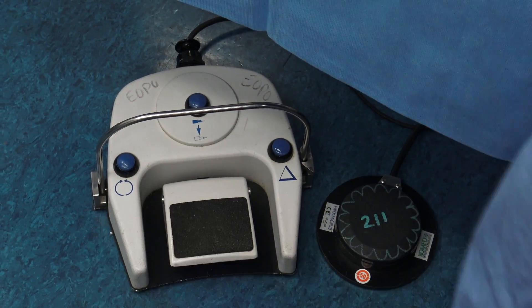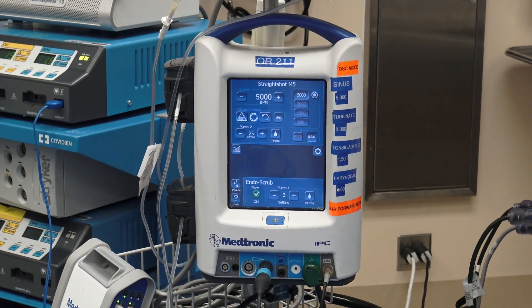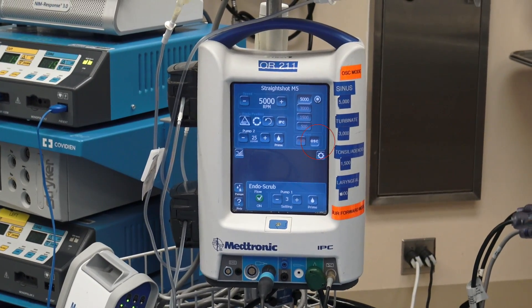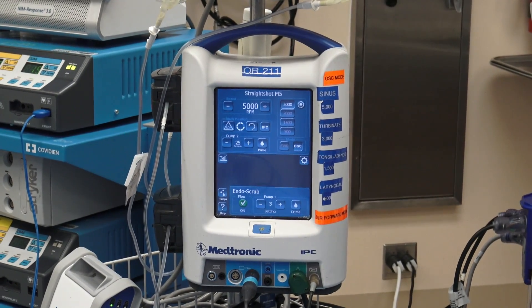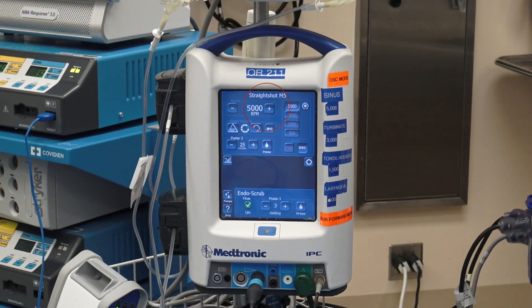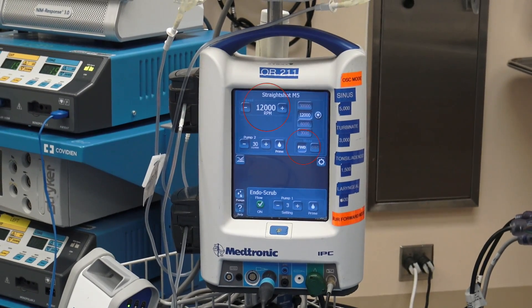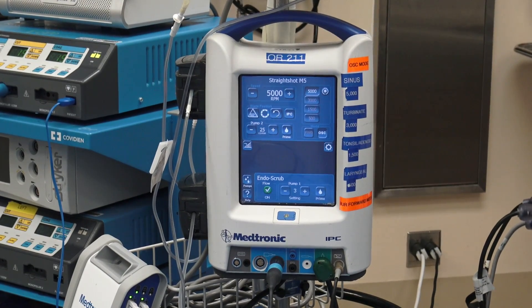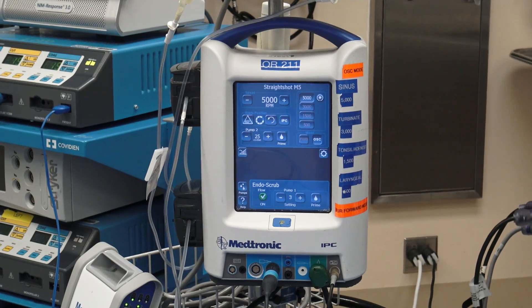The circle button with arrows will allow us to change the RPMs on the machine. Typically for baseline use, we use it between 3,000 and 5,000 RPMs, oscillating as highlighted by the OSC button. It can also be placed on forward — for instance, when you use a drill. Hitting the button once goes up to 12,000 RPMs in a forward motion; hitting it again goes back to 5,000 RPMs in oscillate. You can set it to cycle through several different settings throughout the case.